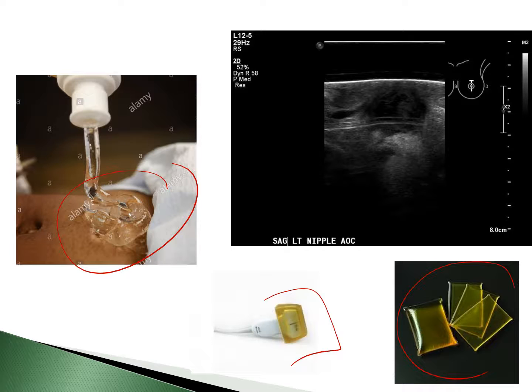But in the end, what they do is create this space in between the transducer face and the actual skin line. So now this is where all those inaccuracies are. This is where that dead zone is. We have the gel separating, and now we can see the true skin line and what's immediately below it. It's very nice for superficial bumps and lumps in the breast or really anywhere on the body.